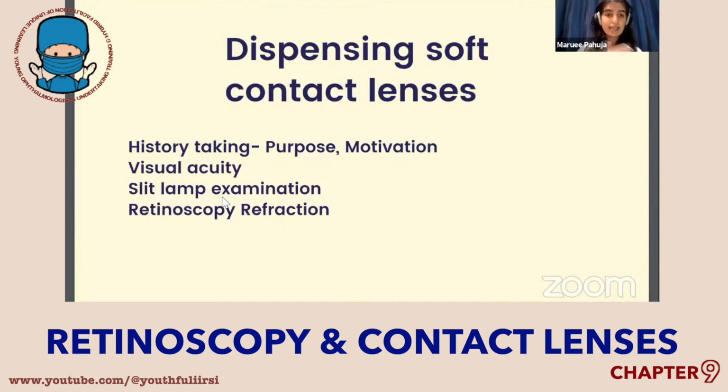child and any adult as well is really important, because you're giving them a visual aid, and the compliance of what they do with it once you've dispensed it is very, very important and is a crucial factor in determining if the patient is going to continue wearing this or is going to land up in dropout. So understanding the purpose and the motivation, knowing that there is no underlying history that would be a factor that you would not want to give a contact lens to the patient.